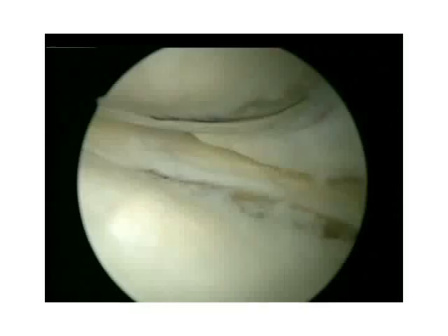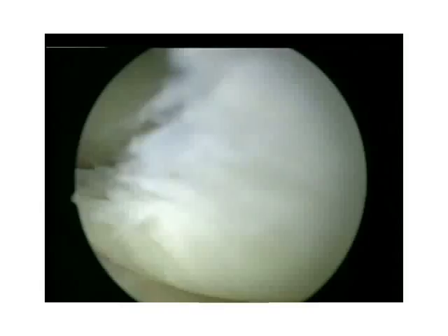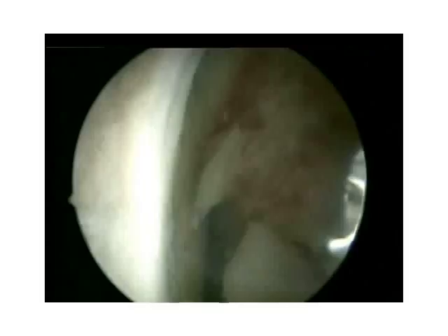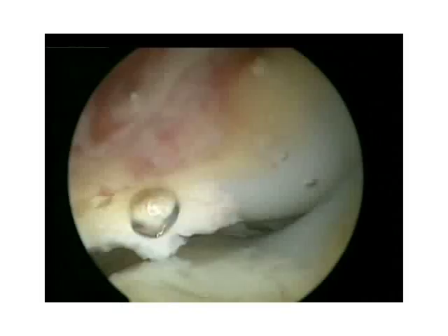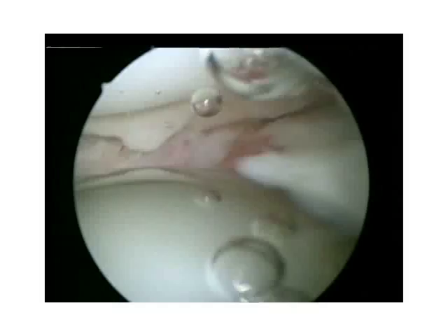With our options left, we went ahead and resurfaced his 1A, 2A, 3B lesion. You could see here, this was the one that got stiff at about 12 weeks, and I ended up scoping him again and doing a lysis of adhesions on both gutters. And what you could see here is, again, the phenomenon of overgrowth. In fact, this is what I call the double meniscus sign, because in the area where I would expect to see this cartilage just get beat up at that interface as the knee is going through flexion and hitting the flare of the meniscus coming down, I didn't observe that at all. In fact, we're observing overgrowth. This is the area where I would anticipate in someone being that heavy to be at risk for delaminating articular cartilage, and in fact, that's not what we observed.